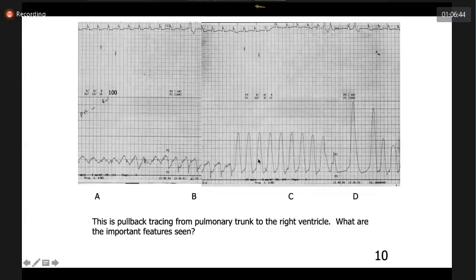Then this is the right ventricular pressure. So this is the right ventricular infundibular. Yeah, I also agree. This is the incisura pressure. This is the infundibular pressure. Yes, sir. And this is the right ventricular pressure. Then what is this? So pulmonary artery pressure, this is at the pulmonary valve, then infundibular pressure, this is right ventricular contour pressure, this is again right ventricular body.